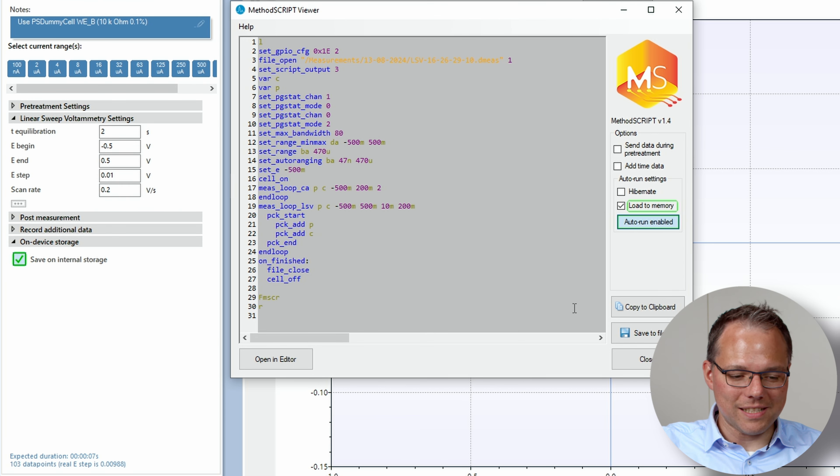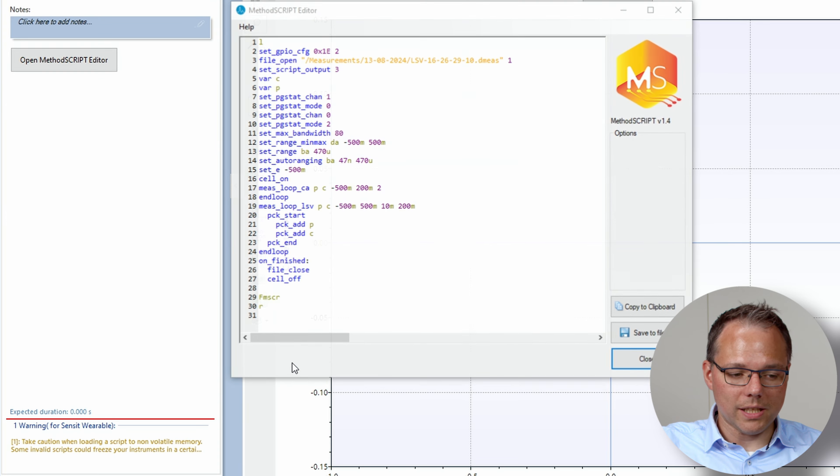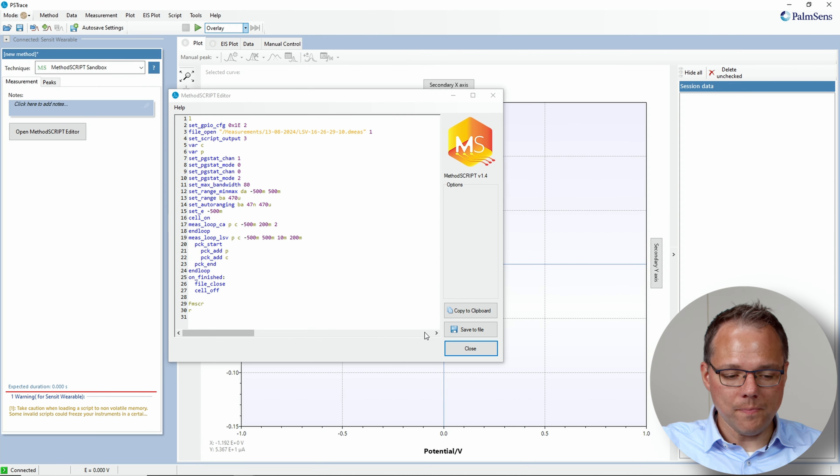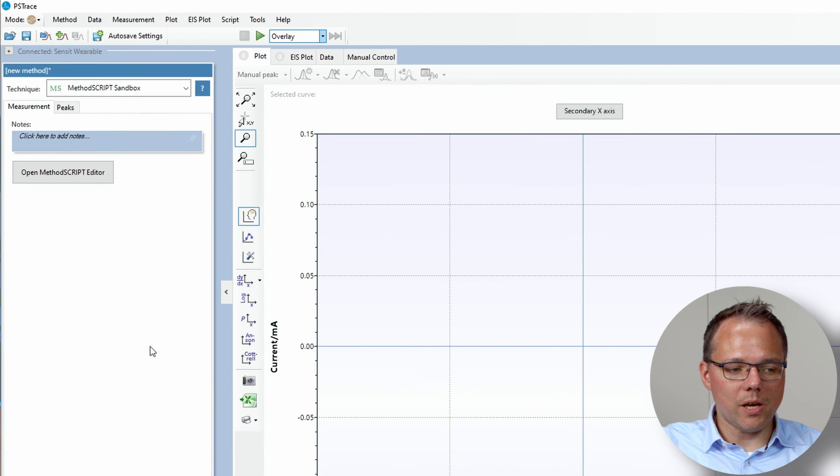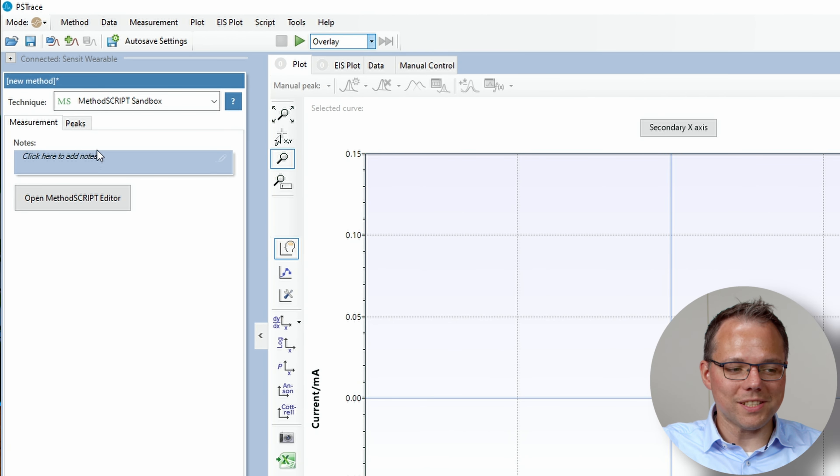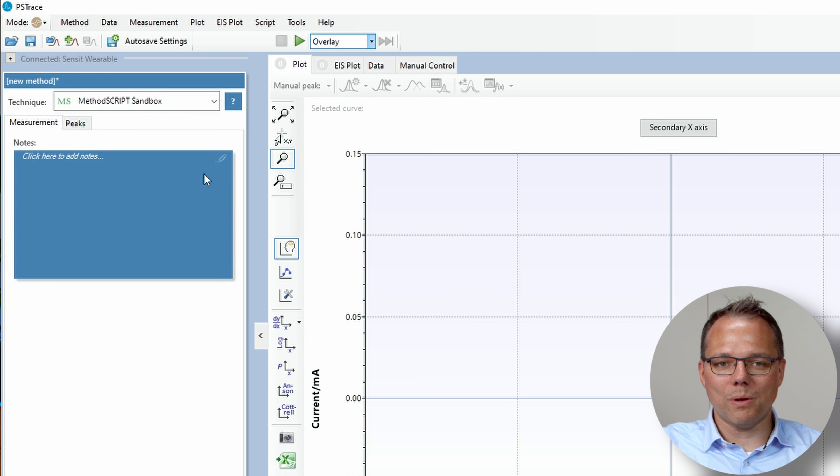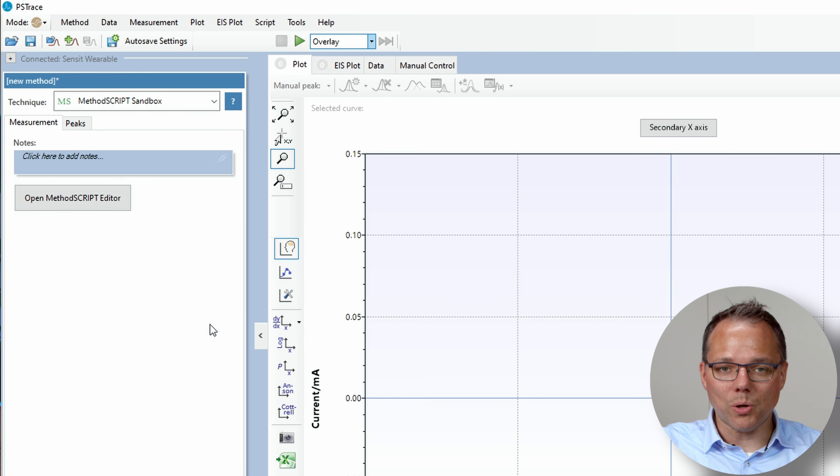To get the script onto the Sensit wearable I need to open it in the method script editor and then I can close it because the only thing that I wanted is I wanted the script in the methods script sandbox.